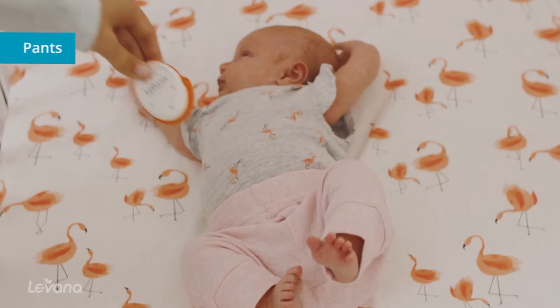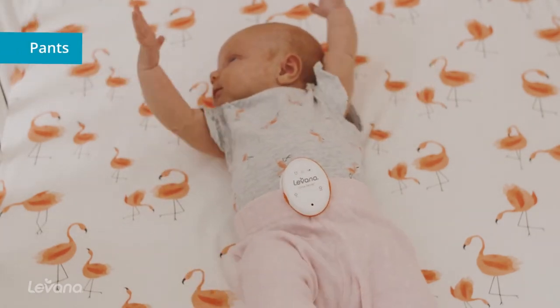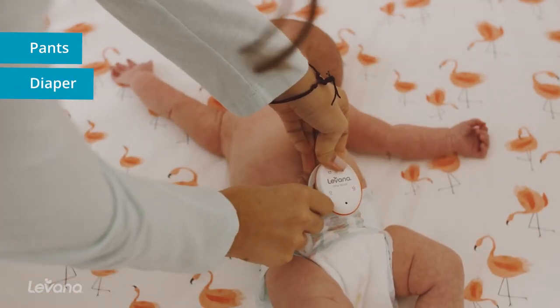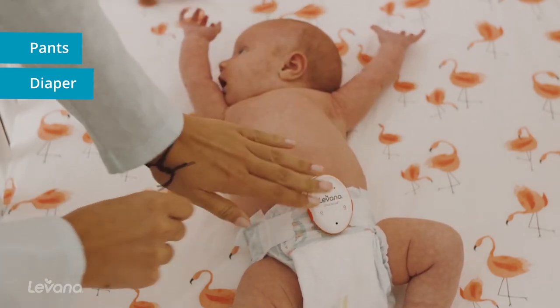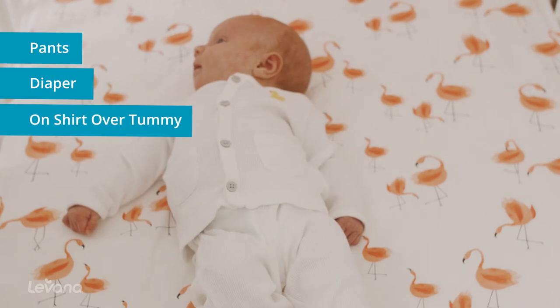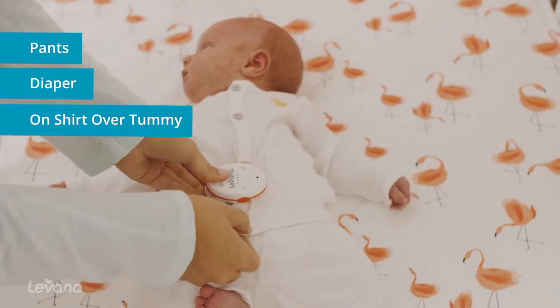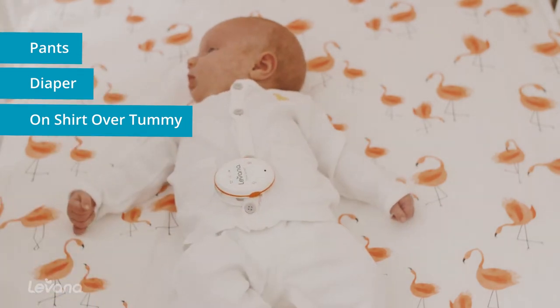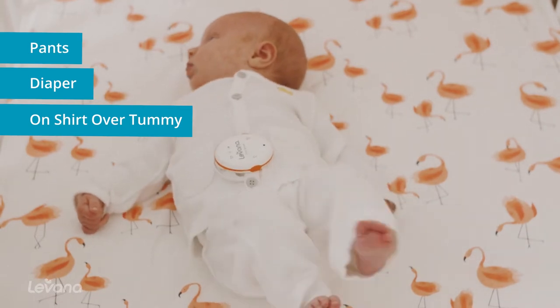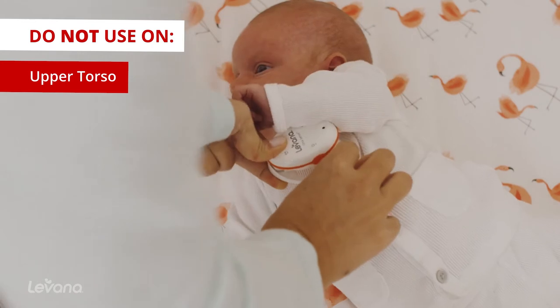The monitor can be placed in the following positions. The monitor will not read your little one's movements in these positions.